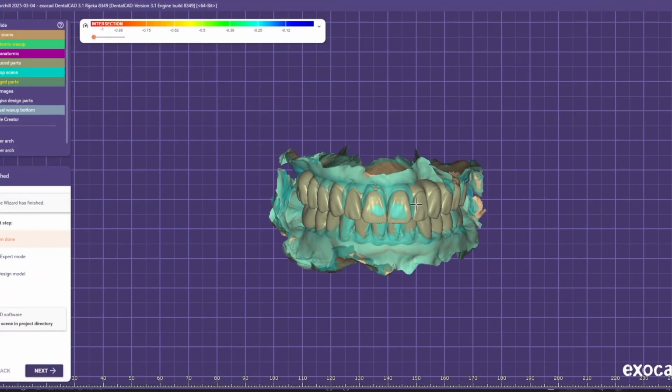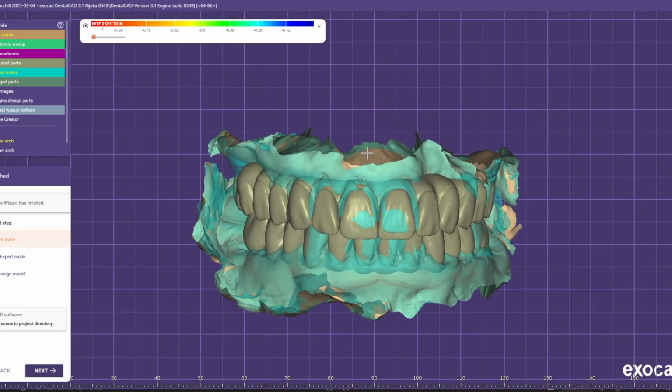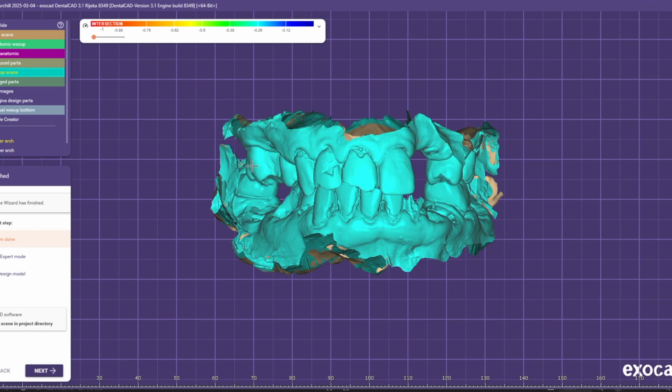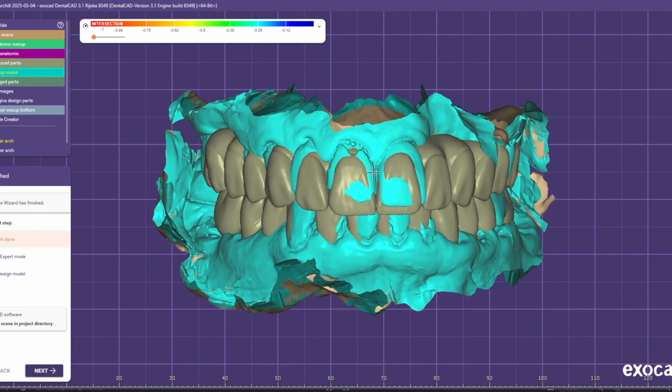We start every case analyzing the photos, taking a look at the scans. So the pre-op scans right here are in this light color. So you got a lot of broken teeth, decay, broken off root tips, and then we do what's called a diagnostic wax-up or a digital hybrid pre-design. And so that's right here. And we want to kind of look, hey, where do we want to put the incisal edge position? Where's the current position at rest?